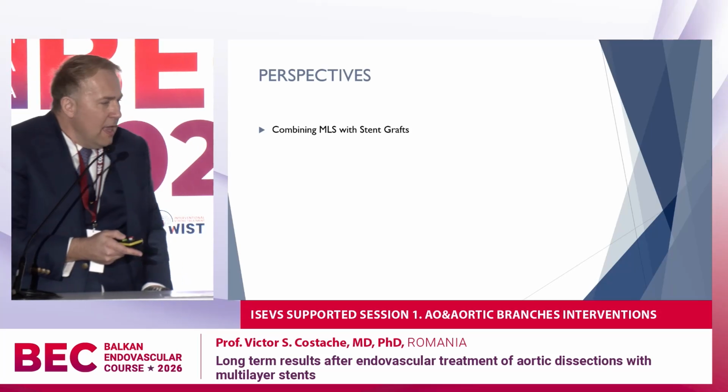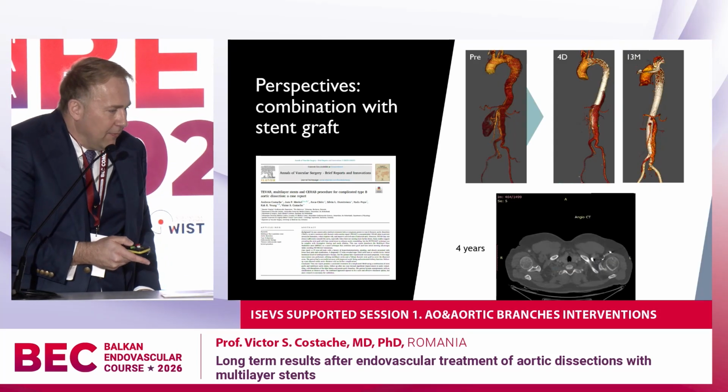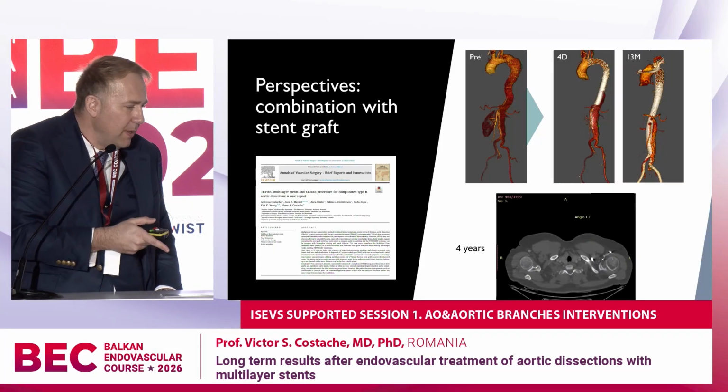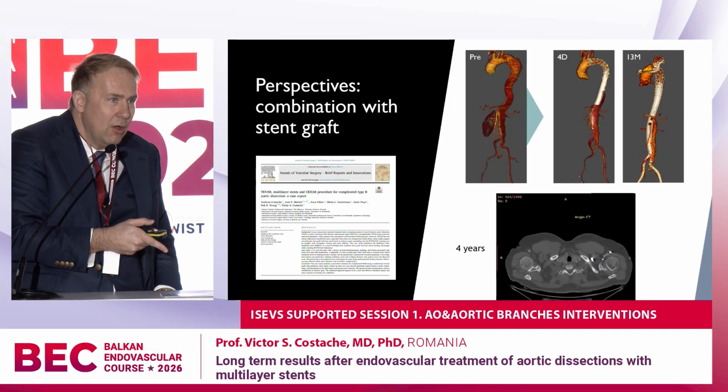So what are the perspectives? Perspective number one, combining multilayer stent with stent grafts. So we have done such a case. You can click play, Peter, please, on the video.